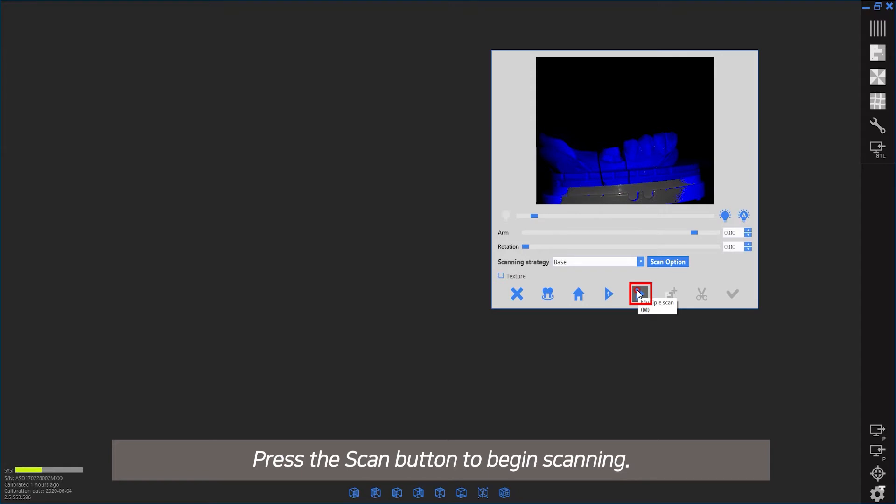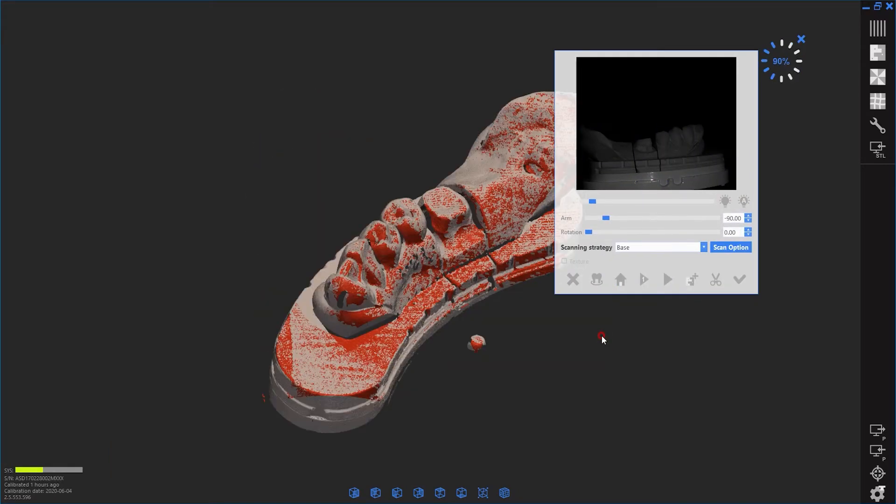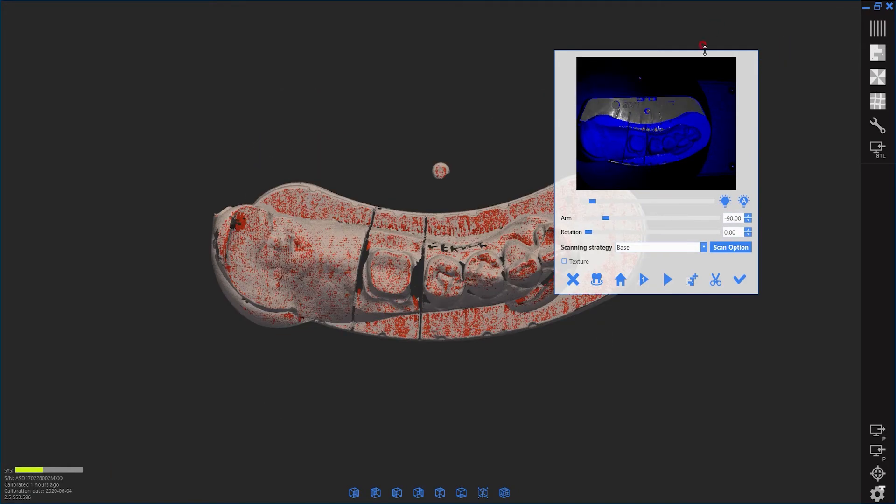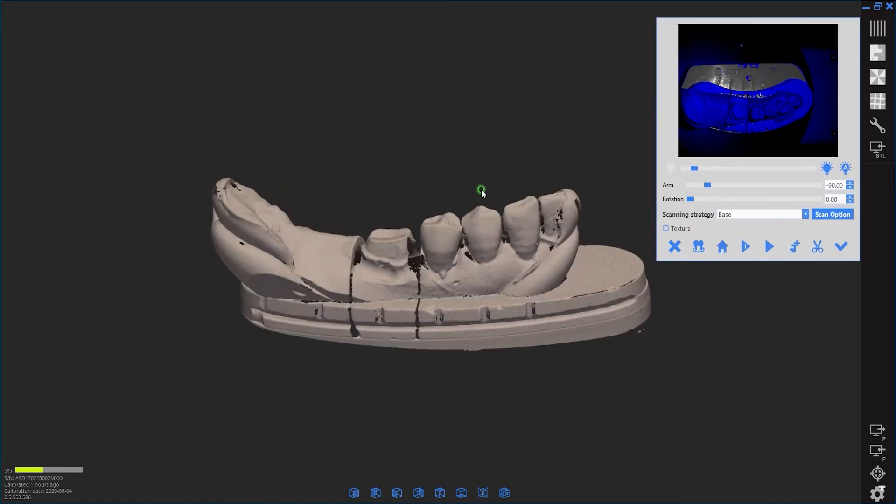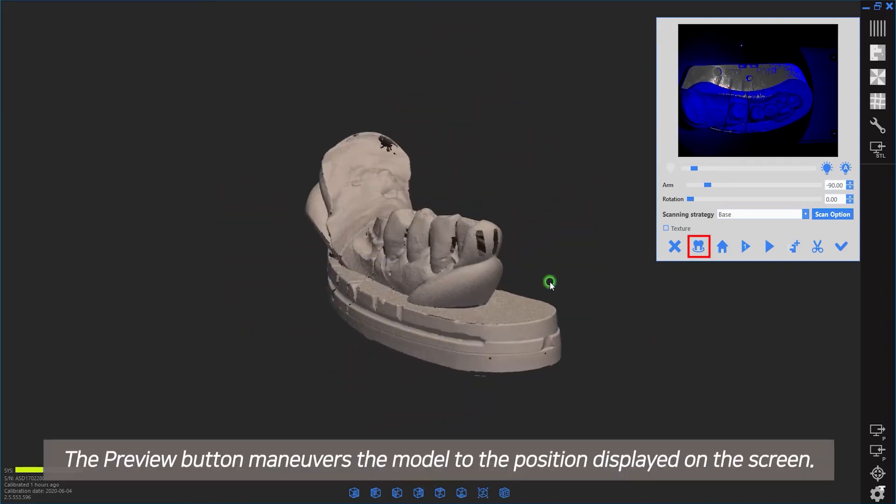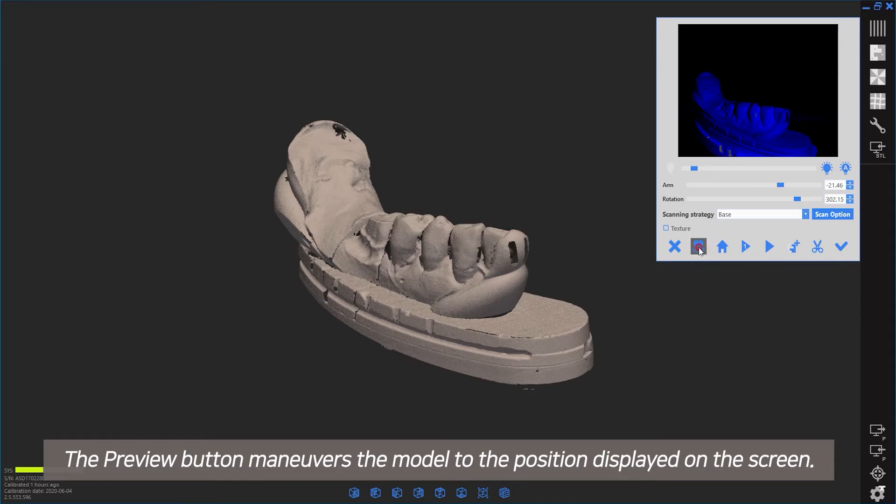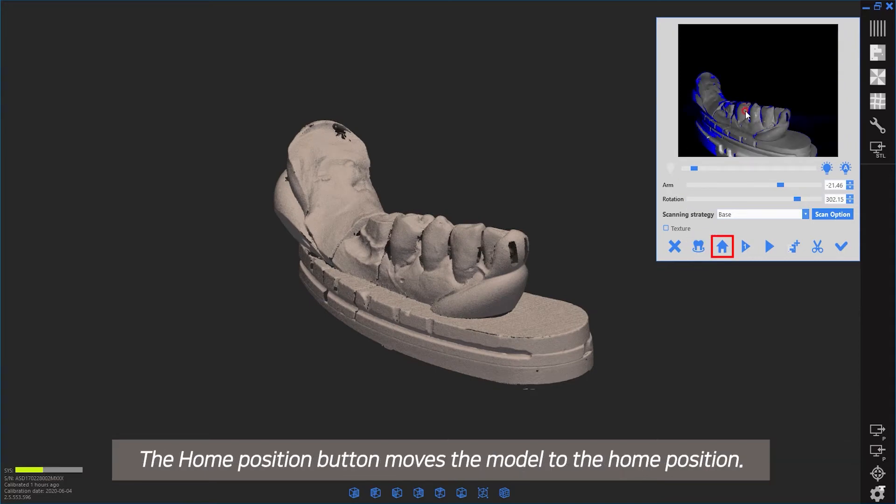Press the scan button to begin scanning. The preview button maneuvers the model to the position displayed on screen. The home button moves the model to the home position.